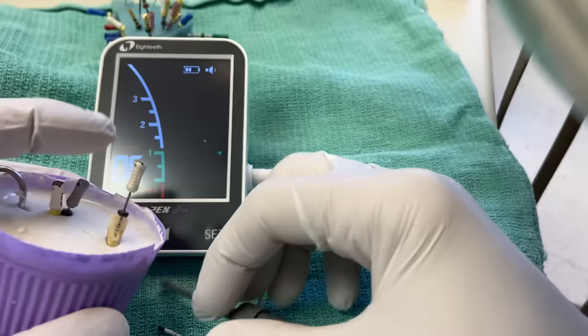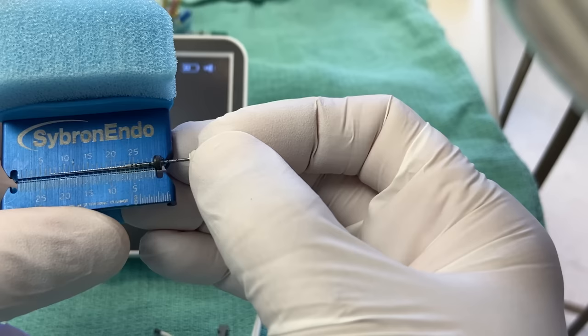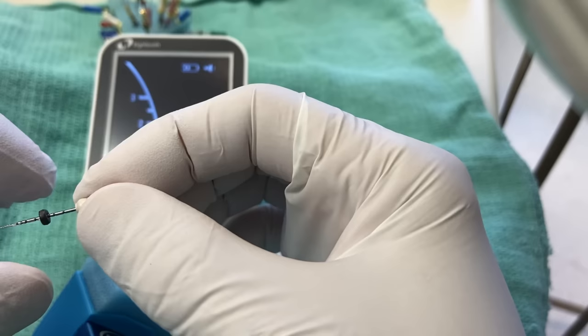So we'll go ahead and measure this. We're at about 23 millimeters, depending on how I move the indicator. I'm going to subtract a millimeter, so my working length is 22 millimeters. That's perfect — and if your rubber stop is in the way, you can just use it on these files here. So 22 millimeters is my working length.